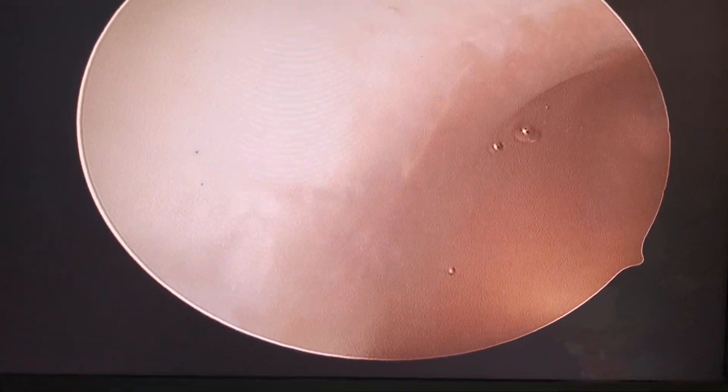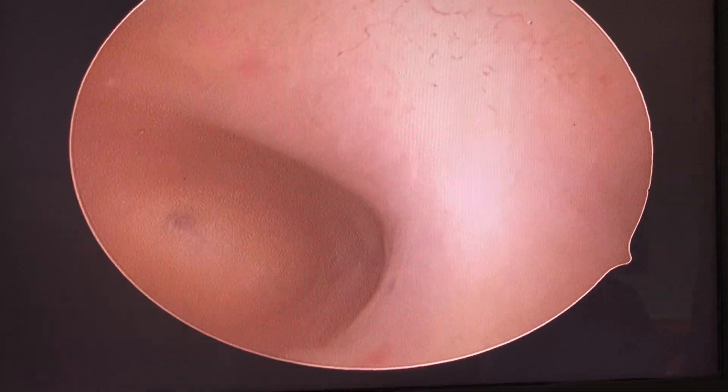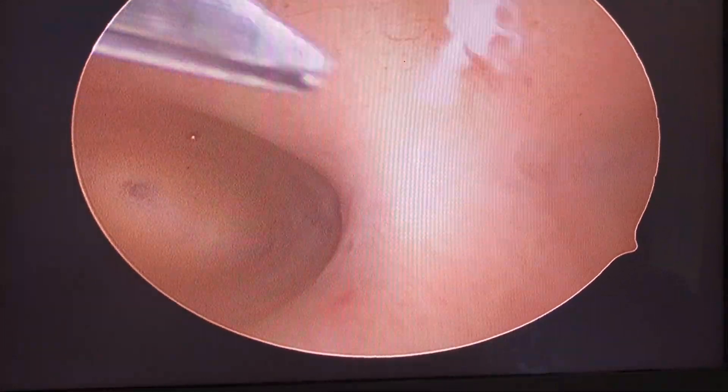My beautiful assistant is Shayna — Shushu is her nickname. You have to pamper your nurses and let them feel happy. Shushu, feel yourself with your hands. Now we are here — should we start? This is the second cornual, and there is the other corneal.